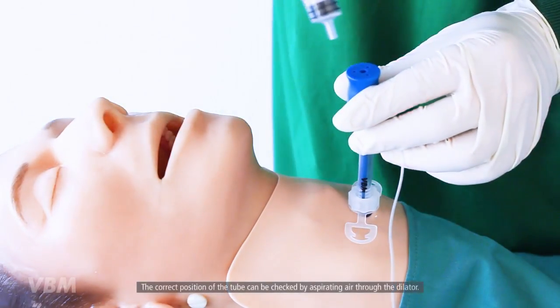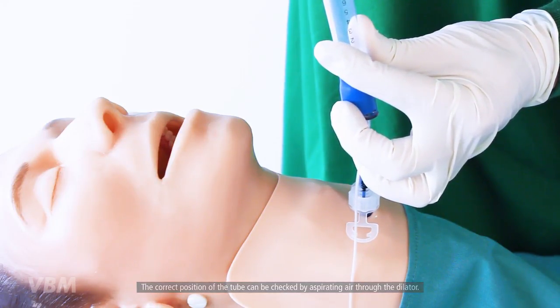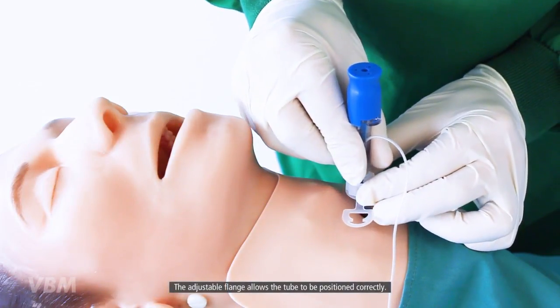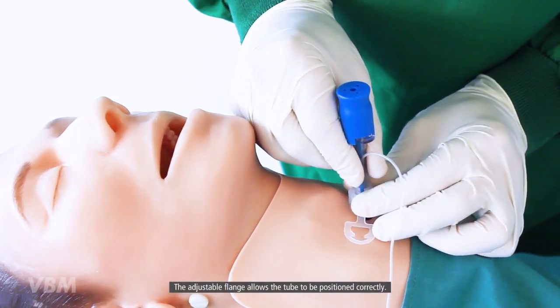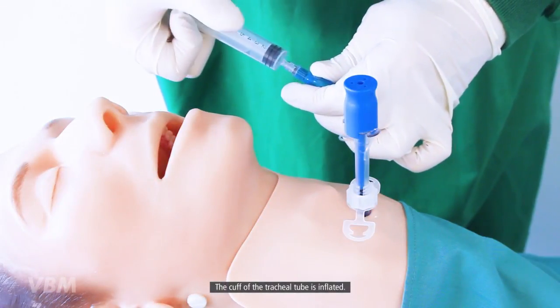The correct position of the tube can be checked by aspirating air through the dilator. The adjustable flange allows the tube to be positioned correctly at the appropriate depth. The cuff of the tracheal tube is then inflated.